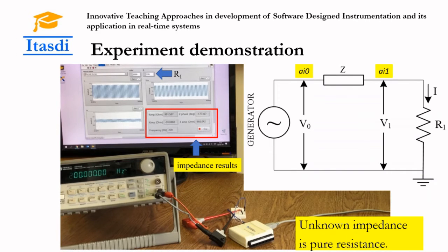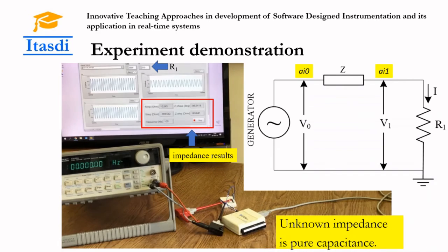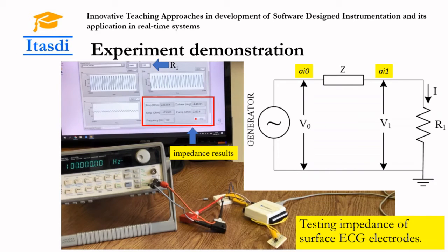This video demonstrates testing the impedance that is pure resistance by the developed application. This video demonstrates testing the impedance that is pure capacitance. This video demonstrates testing the electrode impedance.